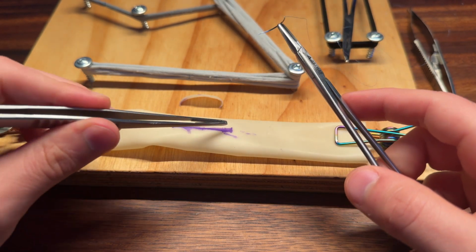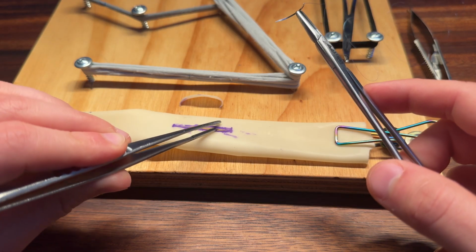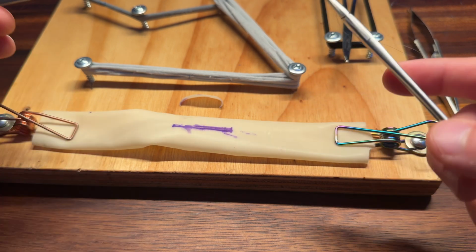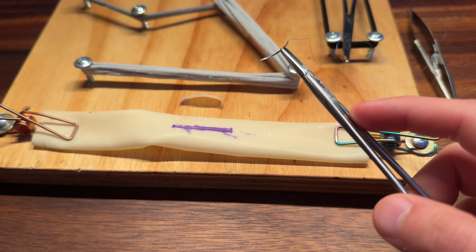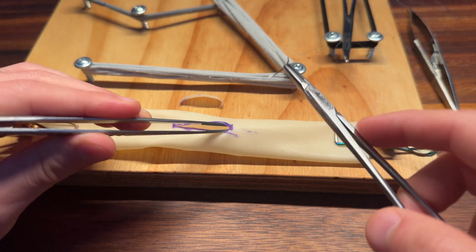Alright, so here are some principles with anastomosing and handling blood vessels. Typically, you want to avoid something like this, where you're really grabbing onto that tissue. This is Penrose tubing, so it's really forgiving, but in real life, whenever you compress these blood vessels, you can injure them, and that might cause something bad down the line, maybe like a thrombus.